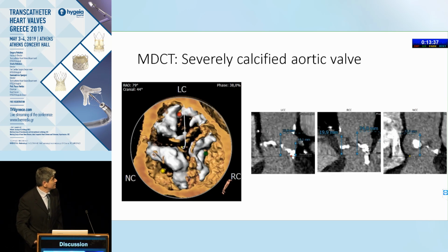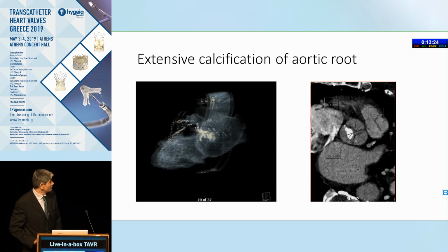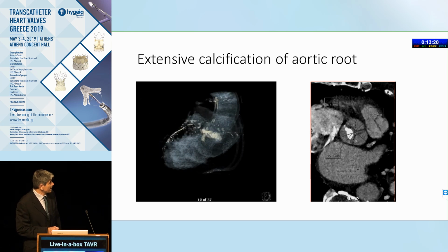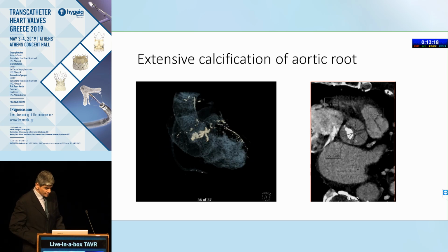Moving on to the CT screening angiogram, we see a heavily calcified tri-leaflet aortic valve with calcifications extending to the outflow tract of the left ventricle. And we can see that in this very nice model. Some heavier calcification on the non-coronary cusp.